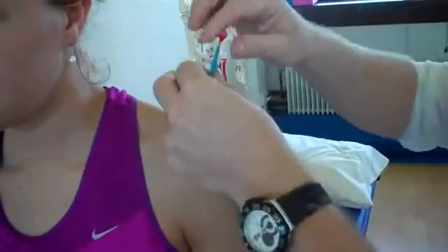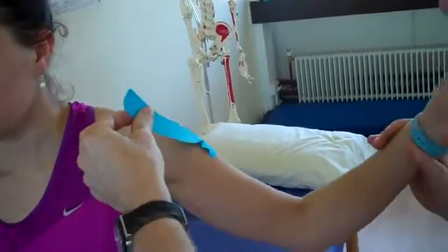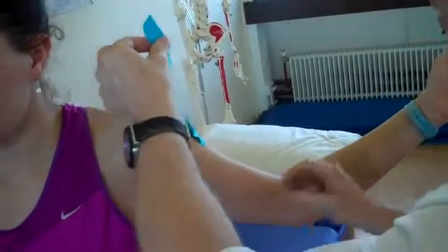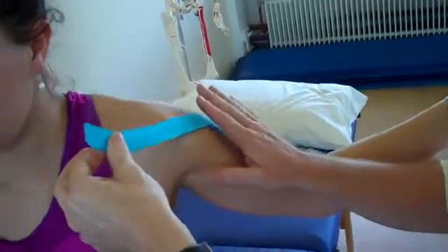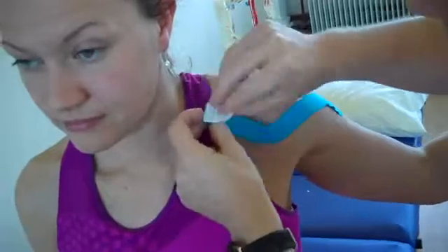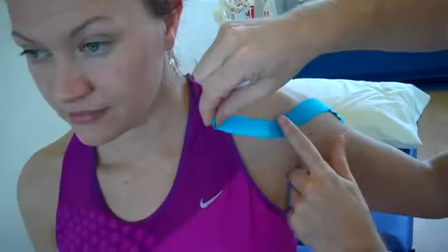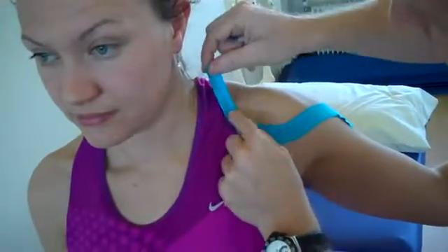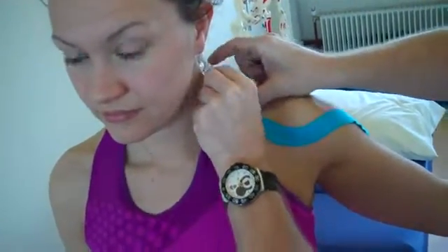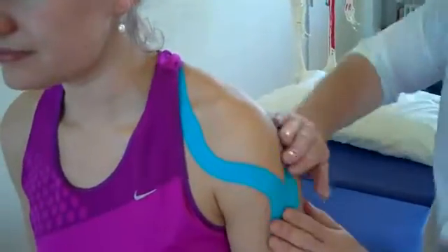To do the anterior aspect, we're going to peel back part of our tape. We're going to place the anterior fibers on stretch, so we bring the arm back — that's what the patient is able to do with a rotator cuff. With no stretch, mould that around and feed this under so we can mould that around. This is just going to tuck under the top, and relax the arm down. That's applying the first bit, which would be used for generalised taping for the shoulder.